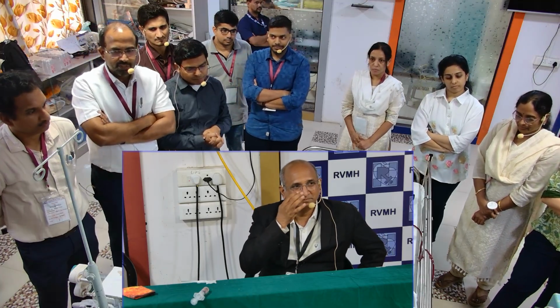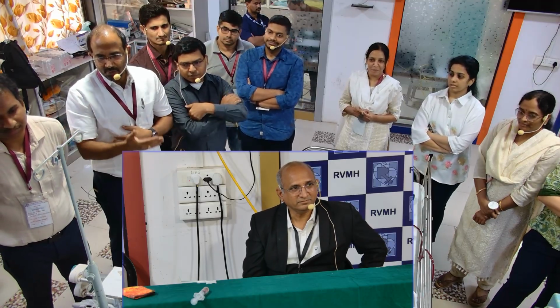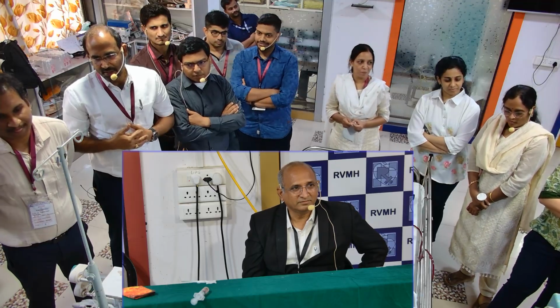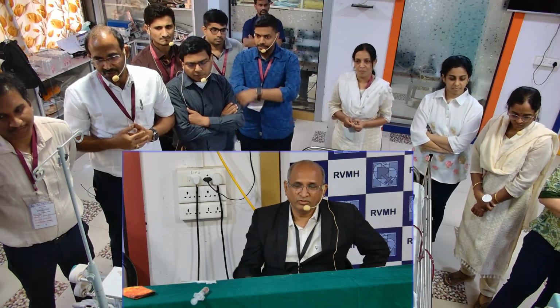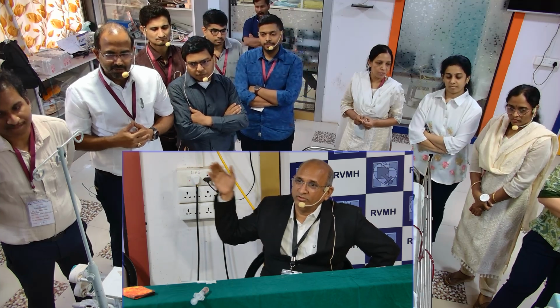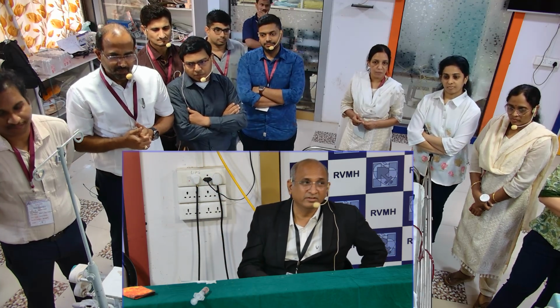Okay. We should check systematically, sir, from one end of the machine to the patient, where the problem is, so that we can identify it. Yeah, so once we have diagnosed that the problem is in this part, right from the source till the end, look at every possibility. Then probably the things would have been easier to diagnose.